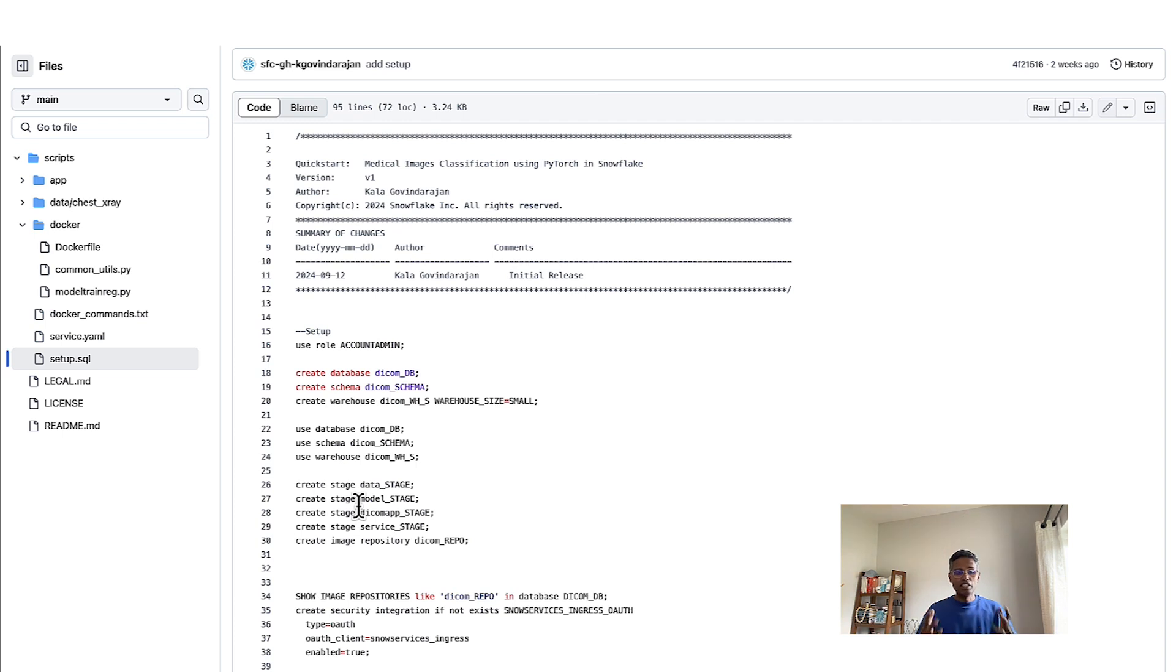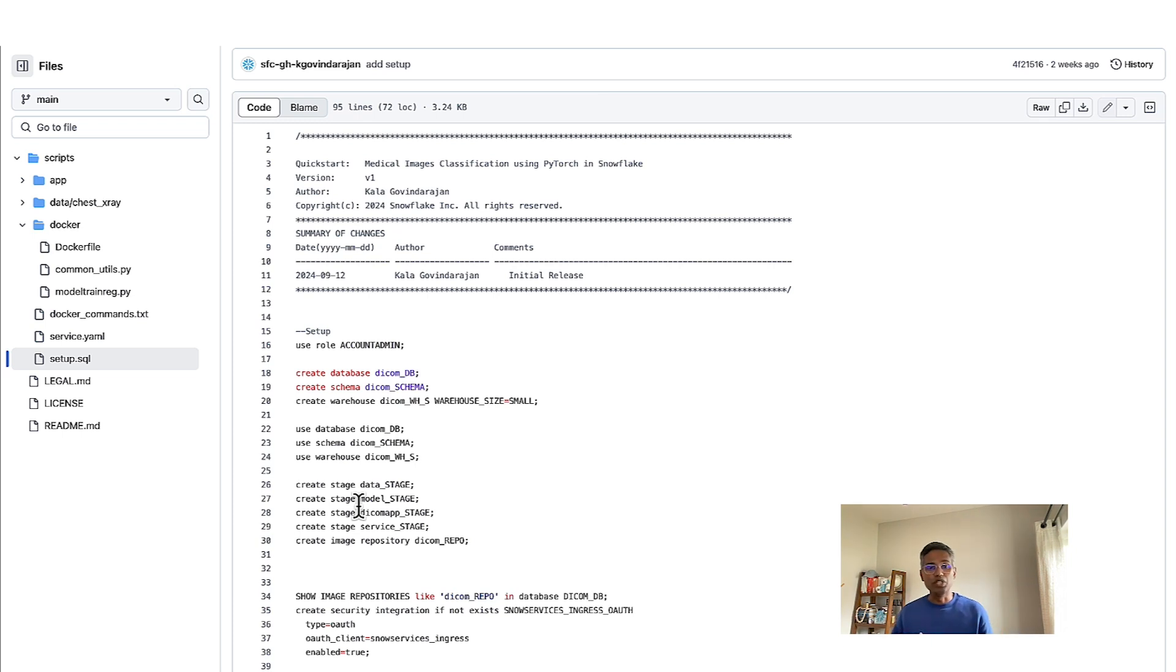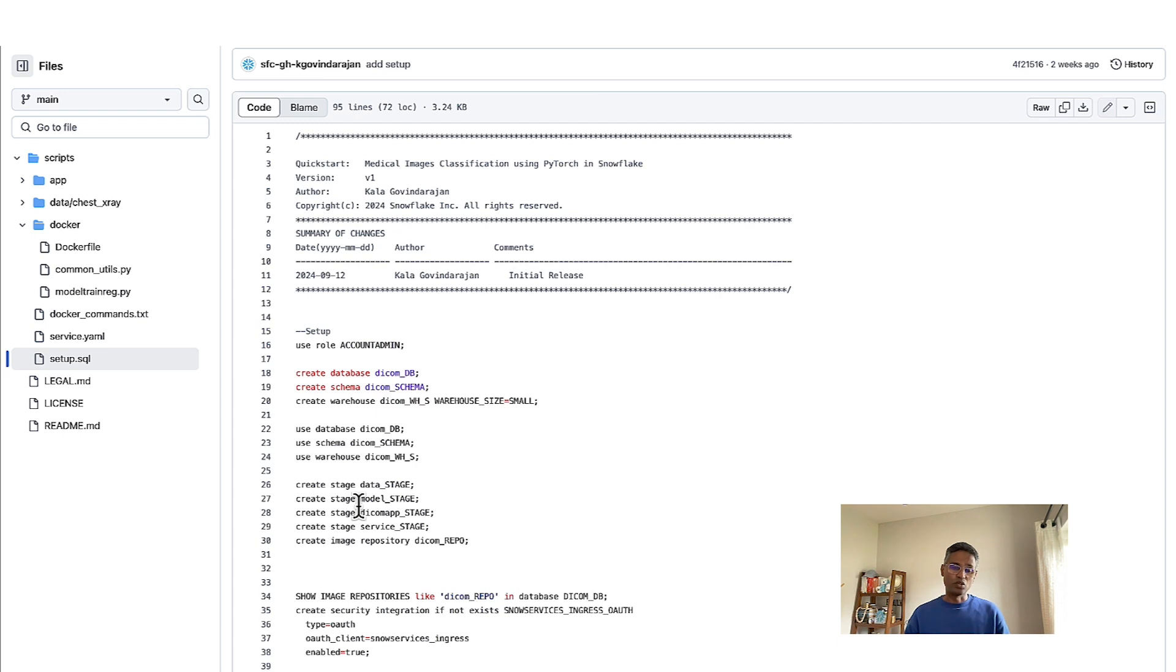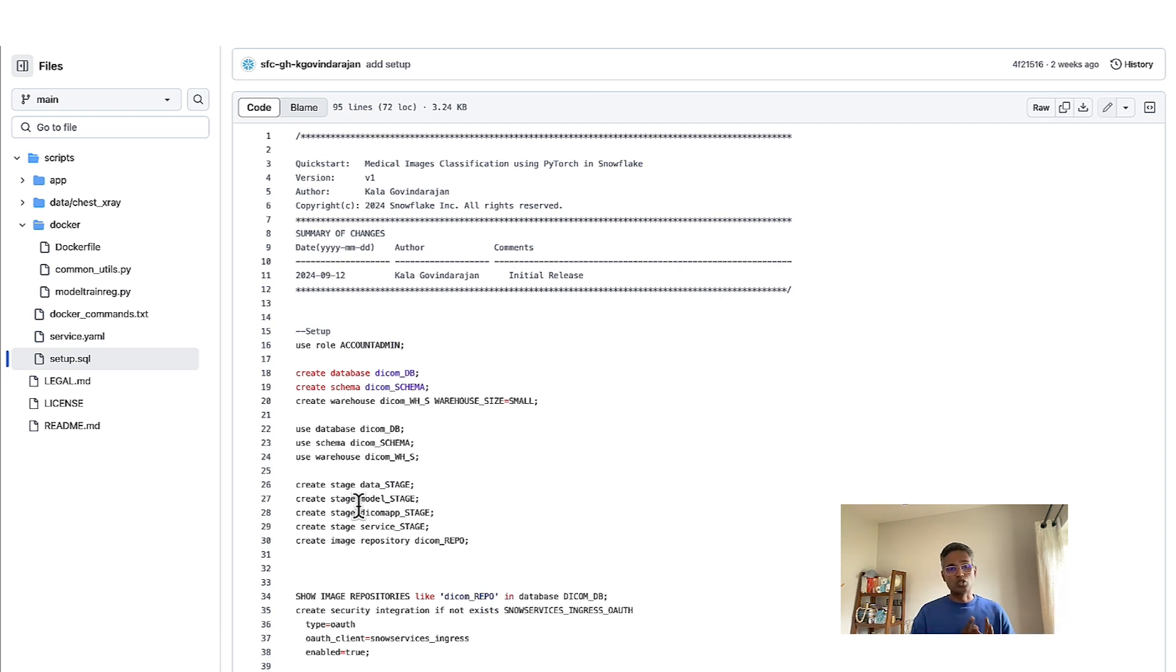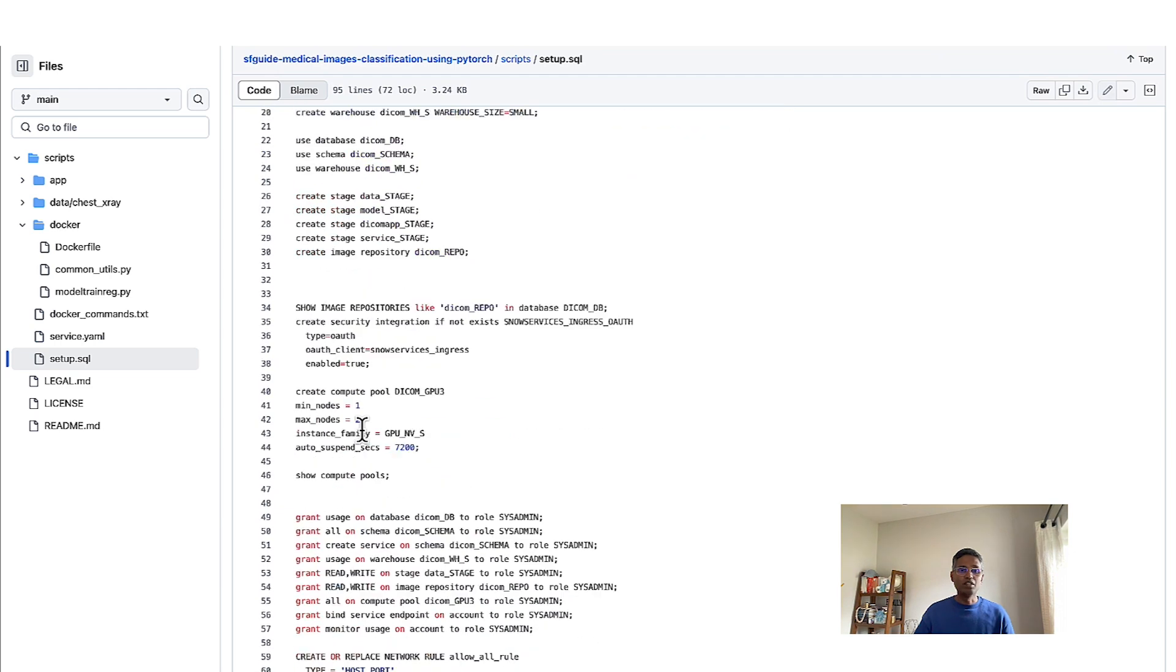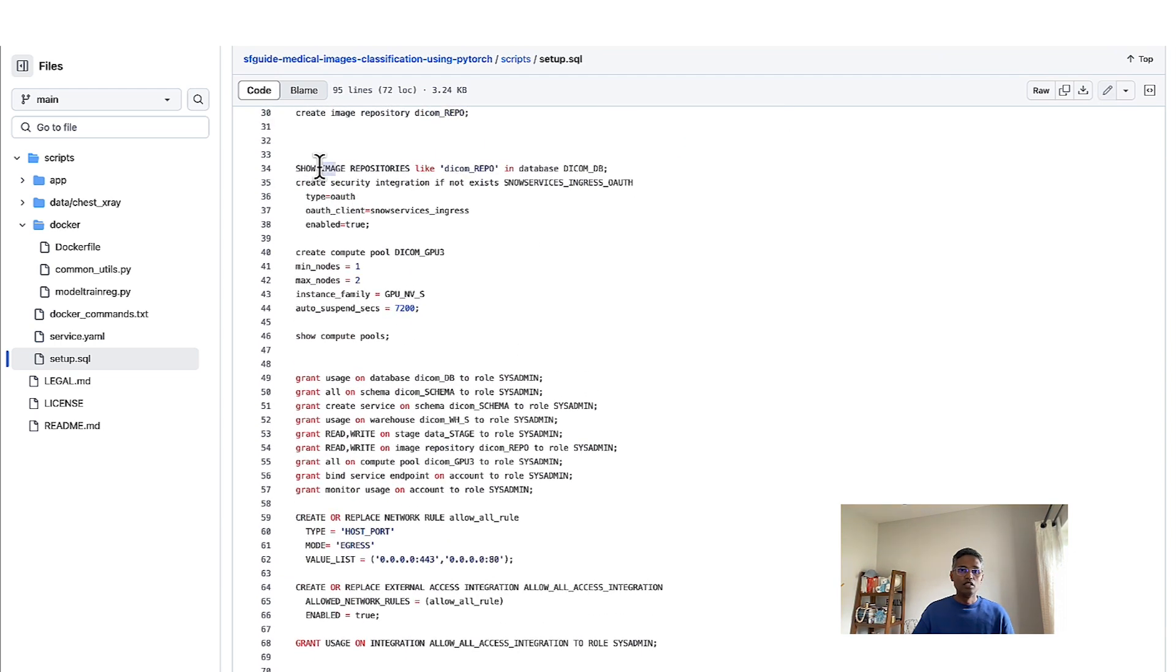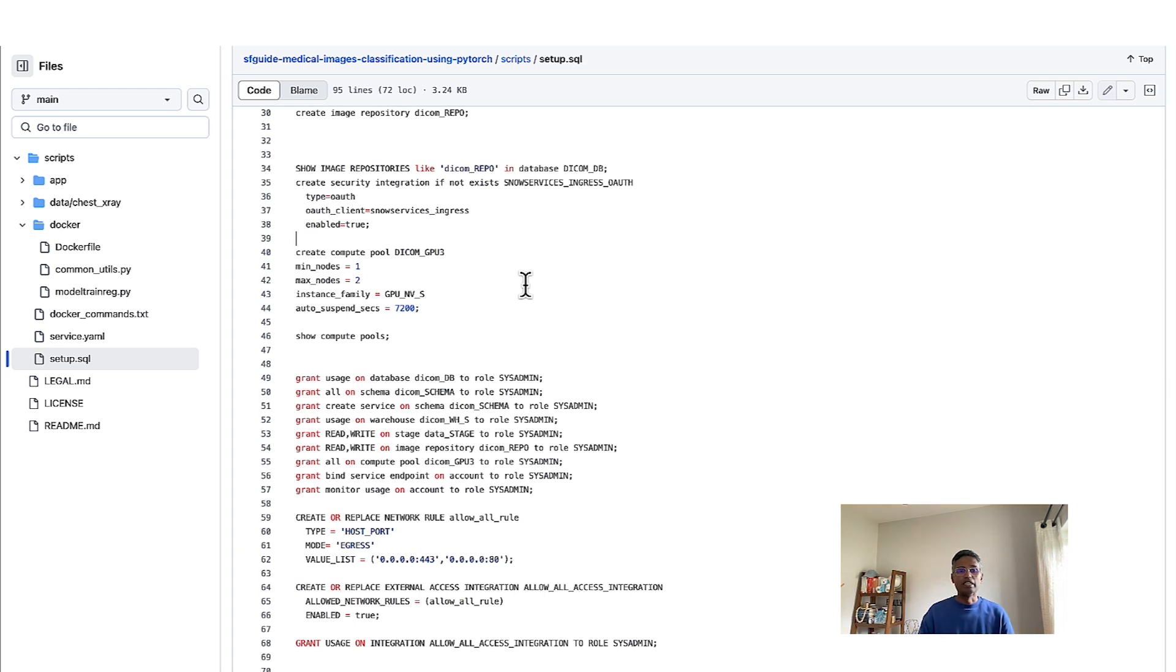Now, the model that we are building today is essentially a supervised learning model and what that means is we already have labeled chest X-rays whether they are pneumonia or normal. That's what we are going to use to train and validate and then we also have some unlabeled images that we will use from an inference perspective. You can create image repositories, the container image repository that I talked about, and then we are defining a compute pool.